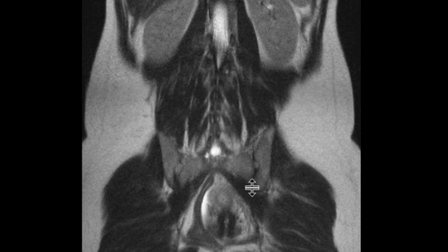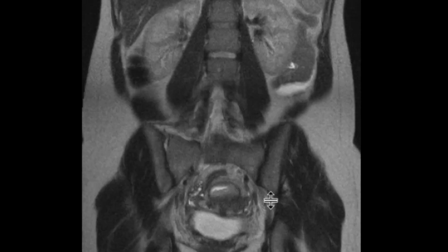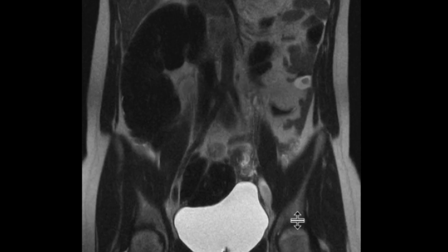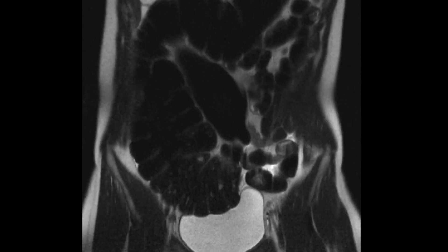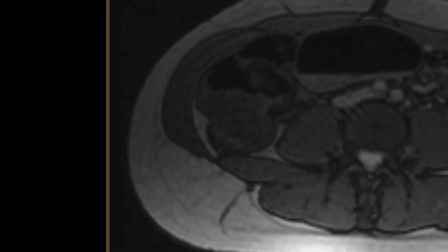Let's follow this back up one more time. You can start to see it twisting around, and just above that level of the twist, the bowel is quite distended.